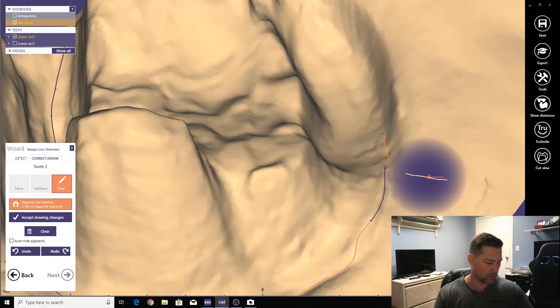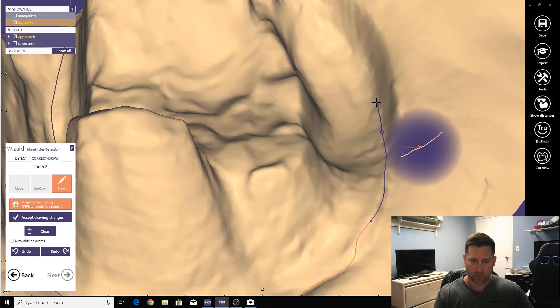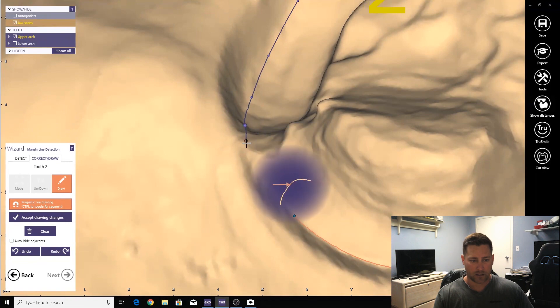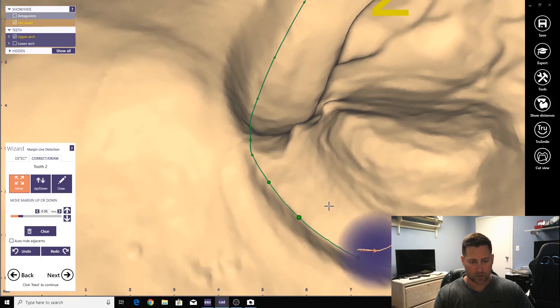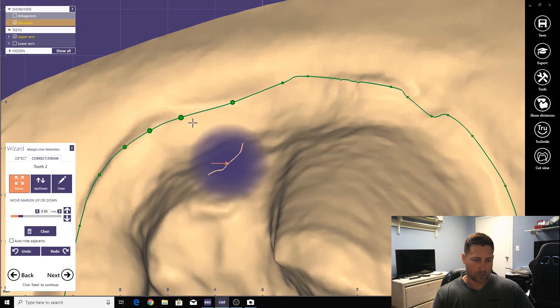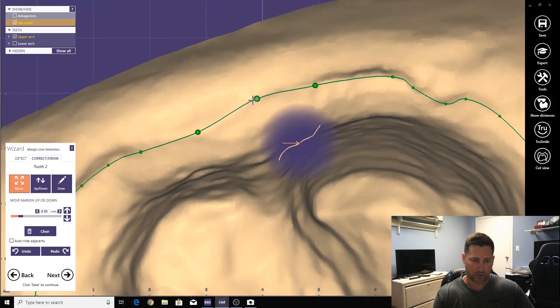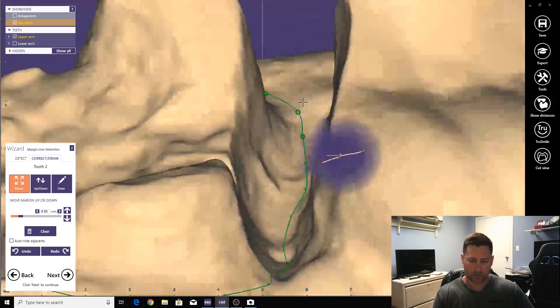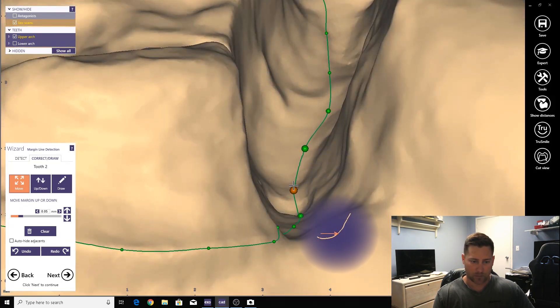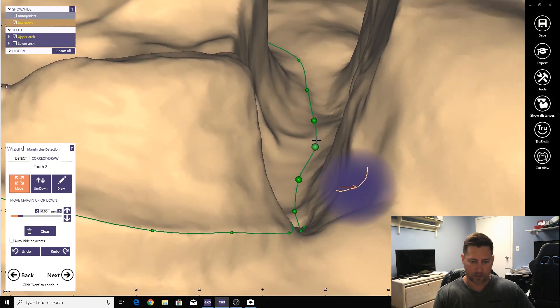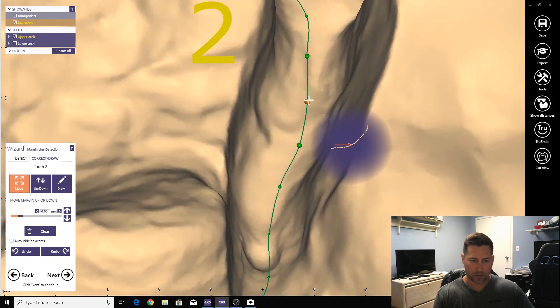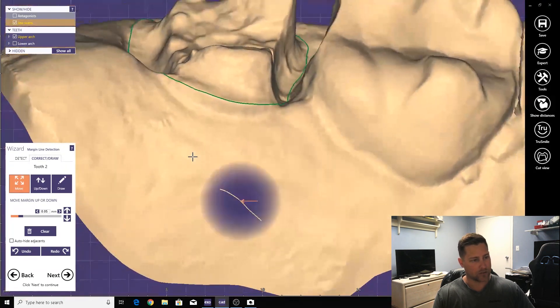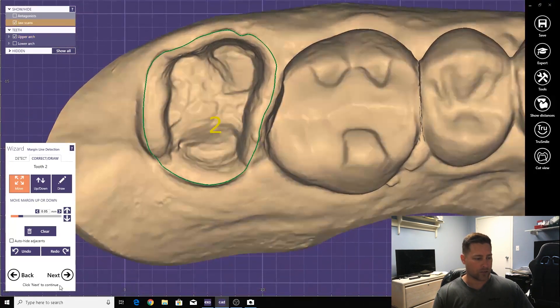Hold down the Control key and it will give you the whole automatic margin-finding tool. It helps on those tougher parts. Come in here and fix this stuff up, clean it up a little bit. I highly recommend a 3D mouse — it speeds things up quite a bit, and once you get the hang of it you'll wish you had it all along. Okay, so there's the margin.